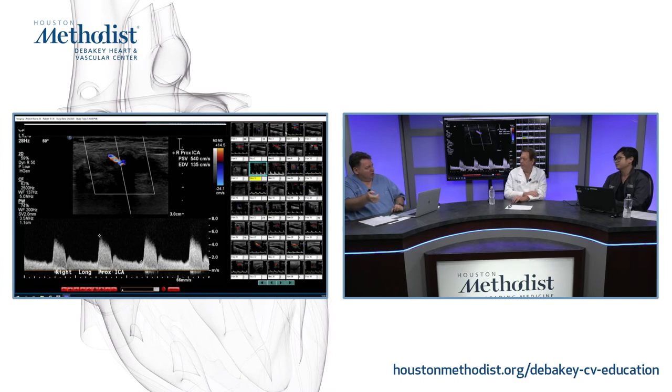You are in the garden and you're pinching down on your hose, and suddenly that tells you this is over 70% stenosis. Pinching down on your hose, that's your ratio going up. That's a good analogy. I say that to all my patients. Imagine you're out in the yard on a hot Texas summer day and you're too lazy to walk over and water the roses. What do you do? You throttle it down and you create this turbulent jet. So that's a good one to use with your patients.